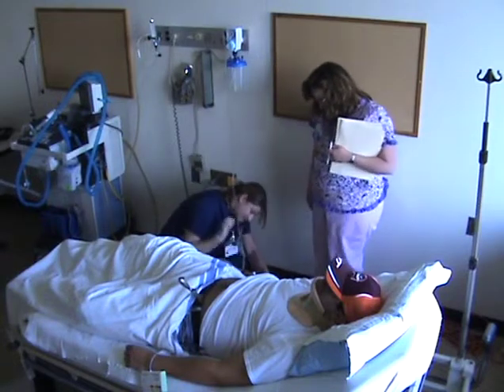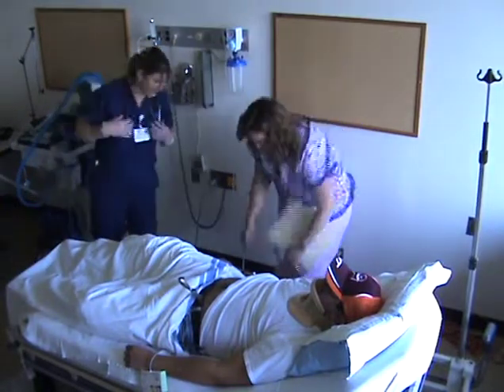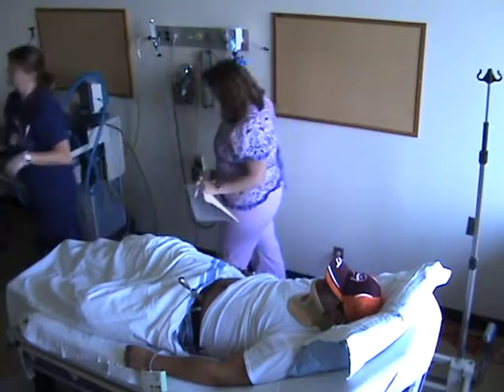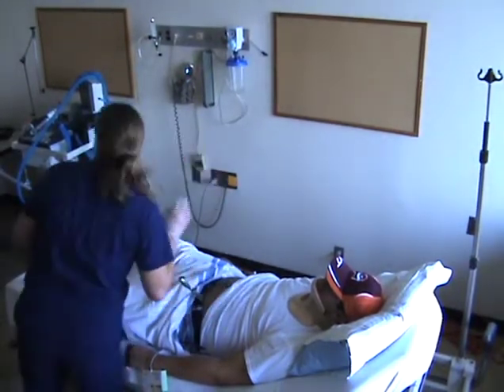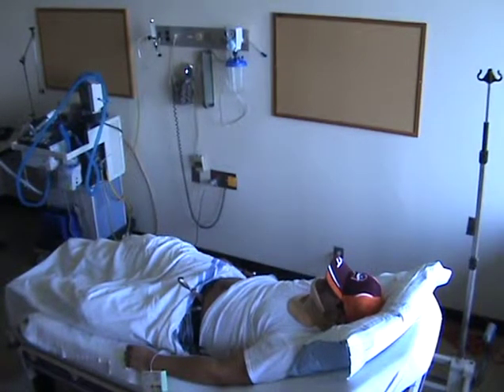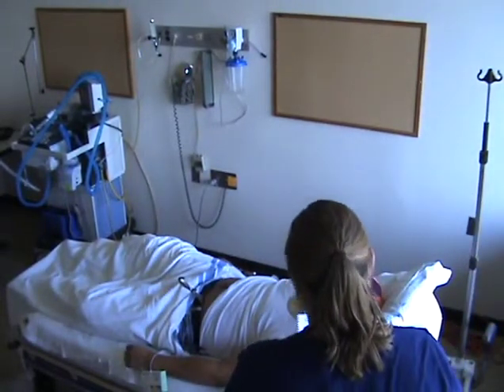Okay, so we got the chest tube in. I can have a free hand if you need it. Okay, all right, and the chest tube's in and it's pulling. Yep, it's suctioning and really no drainage is coming out. You've got to get a seal. Okay. And so do we have it here? He's got the airway secured now. You reassessed, you hear good breath sounds on the right as well as the left. Okay. His oxygen saturation has come up to 95%, 98% from the 78%.